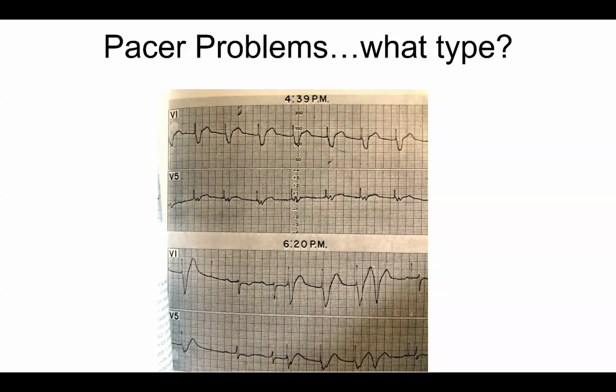However, if the patient happens to have a PVC during the pacing, and the device is pacing asynchronously, it is possible that a pacing spike could fall on a T wave and cause a very bad problem. I have not seen that happen, but there is absolutely no reason it couldn't happen. And so what I normally will say is I'll ask them to try to use as little Bovie as possible and leave the pacemaker on.